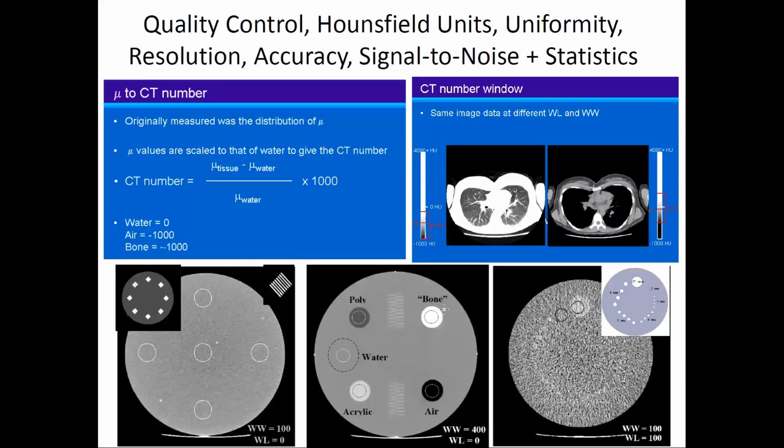Now, the images are all converted to CT numbers. This is another traditional thing. Strictly speaking, if you were being quantitatively accurate about it, it would be the CT number at a particular X-ray energy. But it's a measure of the historical quantitative sloppiness that came from there being a polychromatic spectrum that you're treating as if it was monoenergetic, so there are huge approximations built in from the outset. It was not trying to be quantitatively accurate, but it was close.